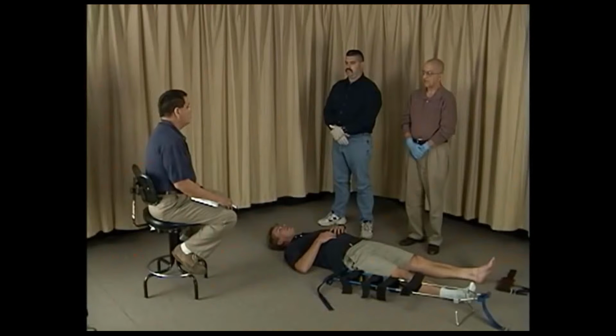Welcome to the traction splint station. You've had an opportunity to check your equipment. Do you have any questions? No. Okay. You've done an assessment on your patient and you determined that they need a traction splint applied. So go ahead and show me how you would do that.